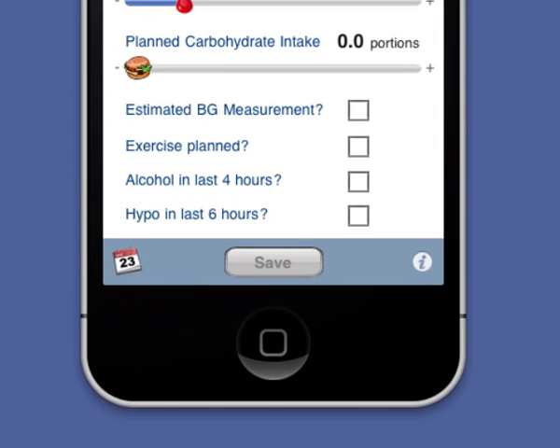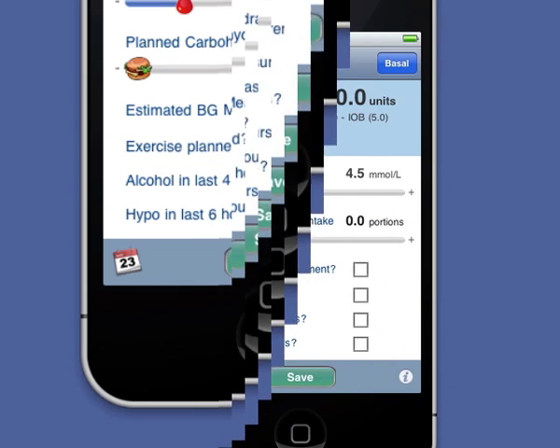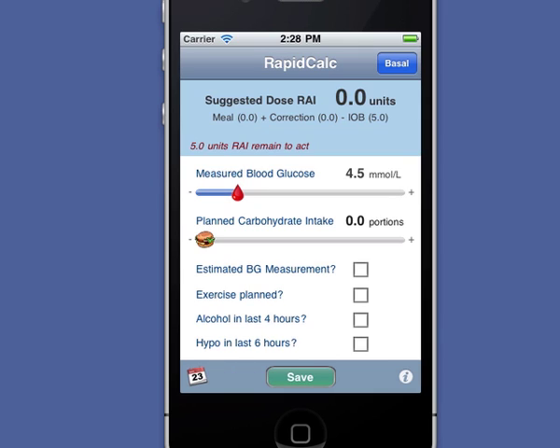If I tell RapidCalc that I've experienced a recent hypo or had a drink, it'll adjust the suggested insulin dose in accordance with recommended safety guidelines. I can mark a record to show that my blood glucose reading was an estimate or that I'm planning exercise. All this information and any notes I add are stored in the dose record and flagged with an icon in the history view.